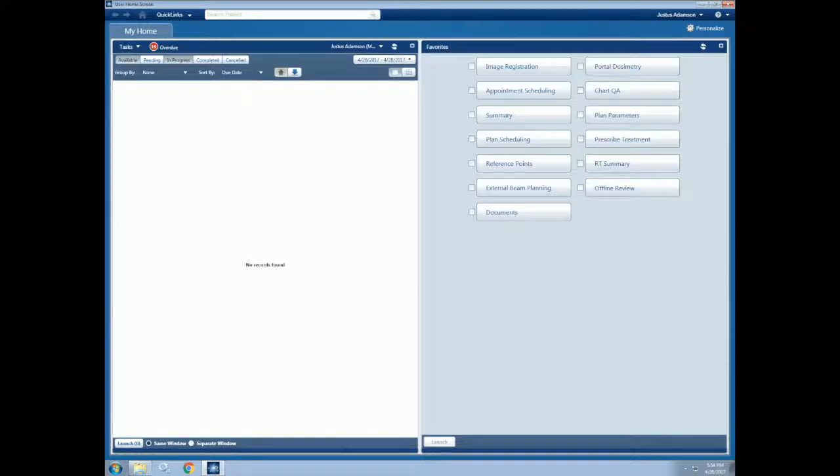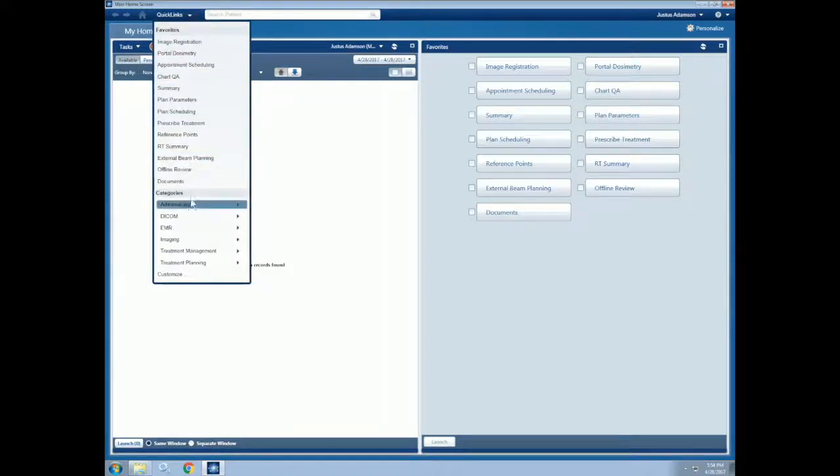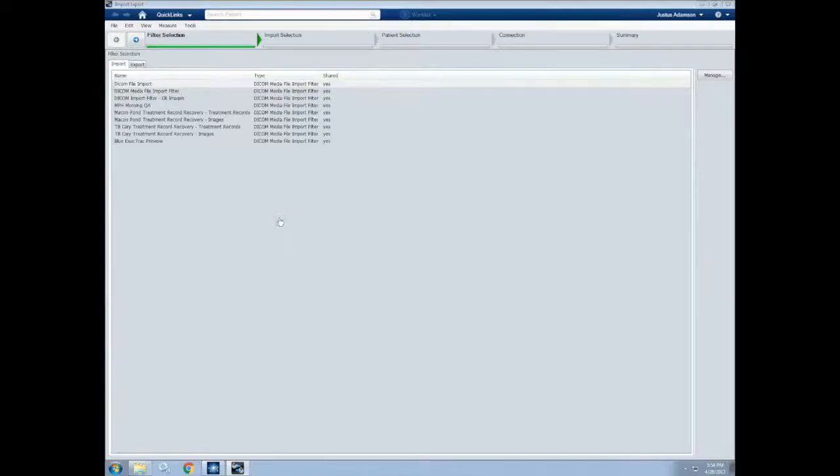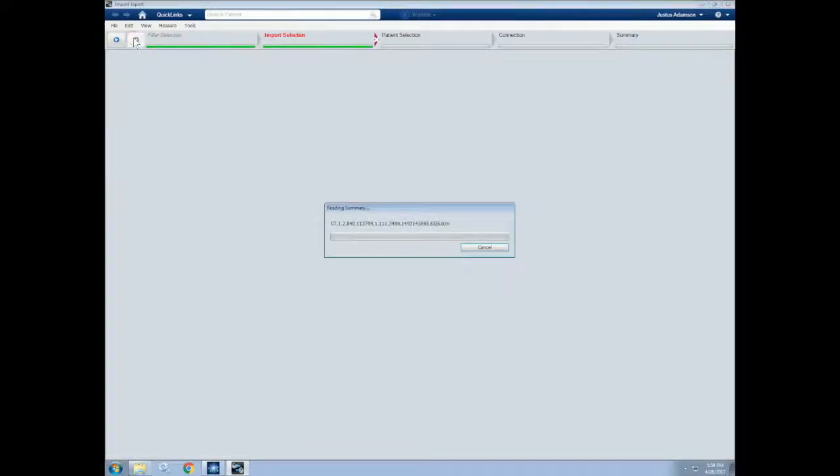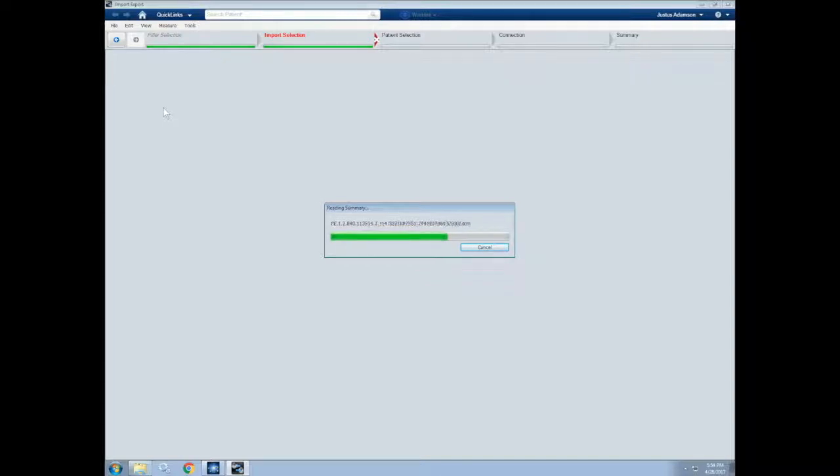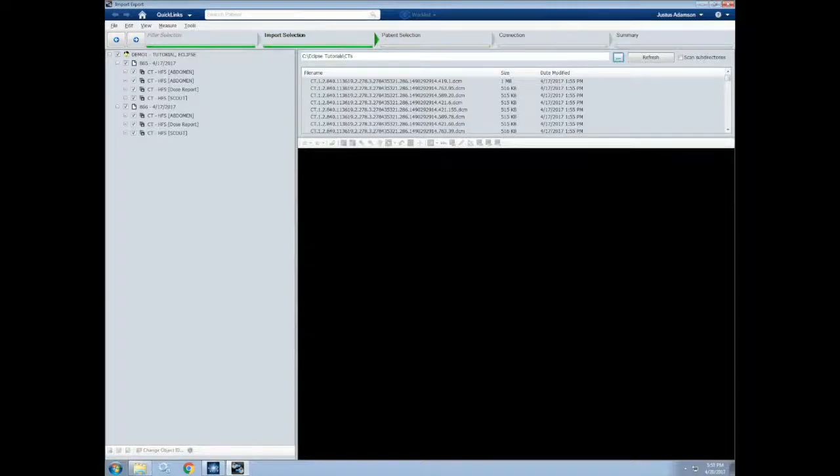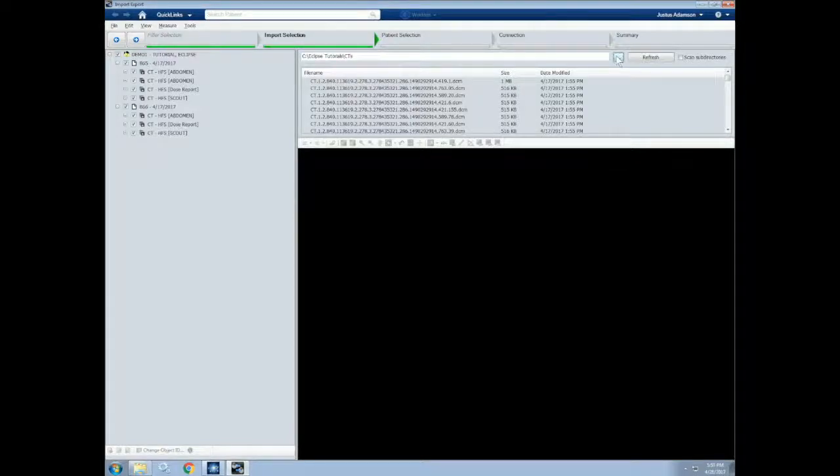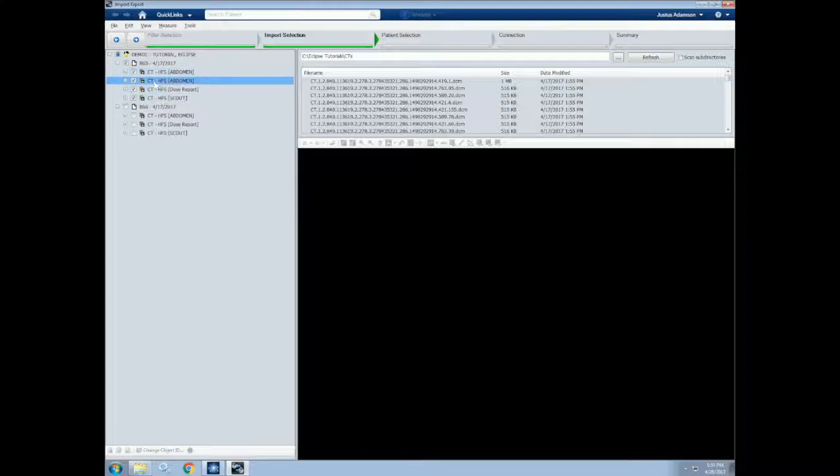Let's import images for a new patient that we will work with throughout the rest of these tutorials. To do so, we can select Import/Export from the DICOM option in the Quick Links dropdown. This launches a new Import/Export window. We can then make sure we're on the Import selection, click DICOM File Import, and click Next. This will load all of the CT's and other images that are in the current directory. We can change the directory by selecting this button with three dots. Once the images are all loaded, we can select the ones that we want to import and click Next.